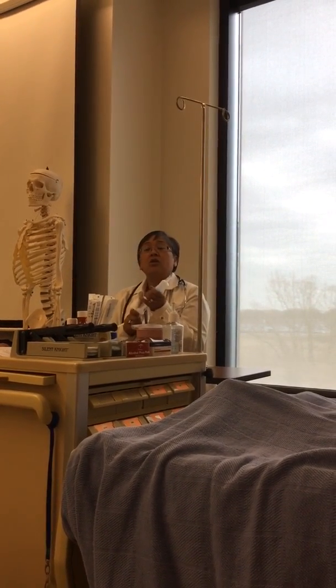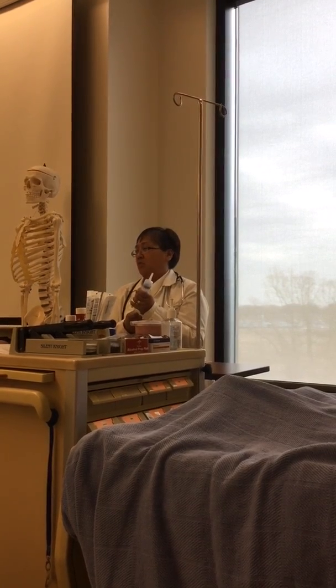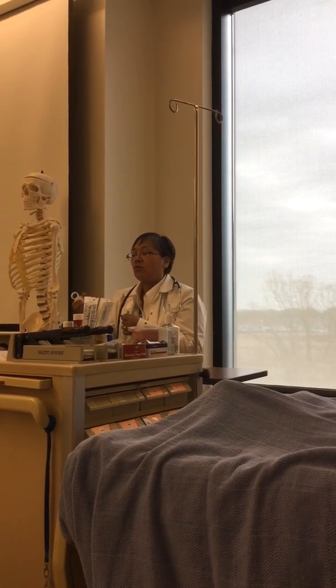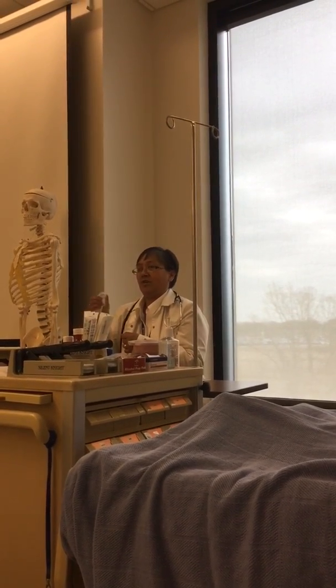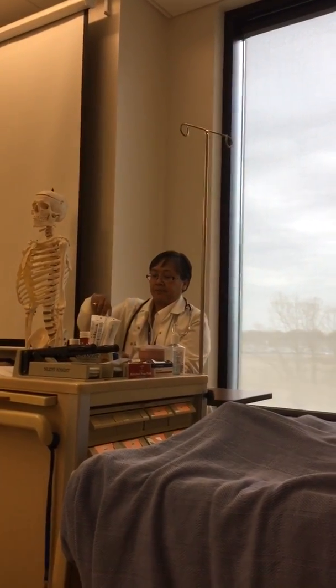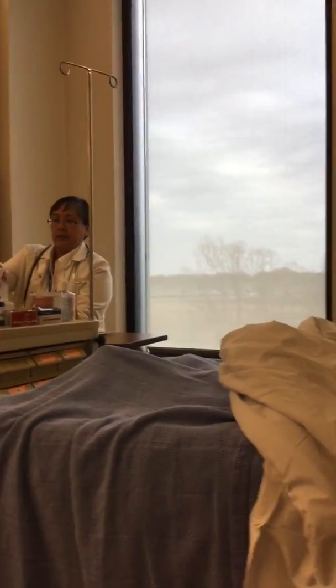Play with just the manipulation of up and down, because you don't realize how much force you have to push on these things, especially when you give medications, because if you don't crush things properly, it's very difficult to get the food down and stuff. All right, so you'll need this.